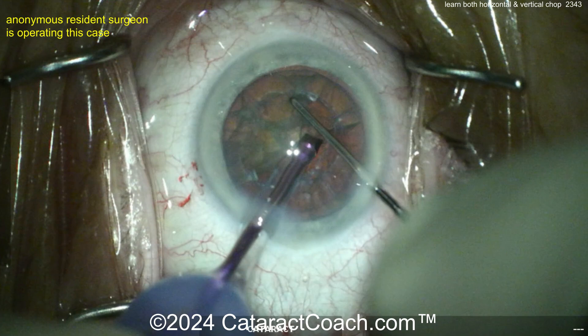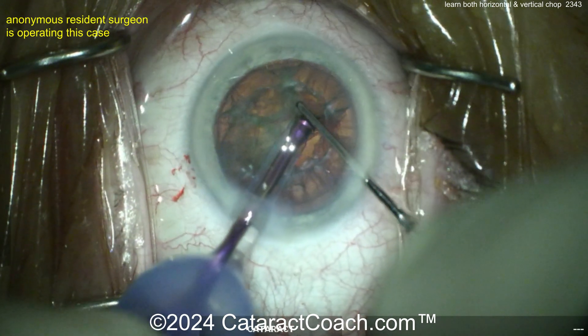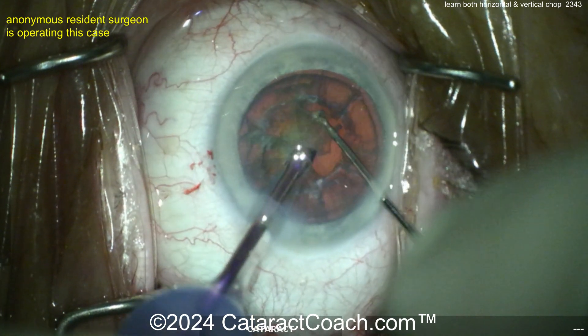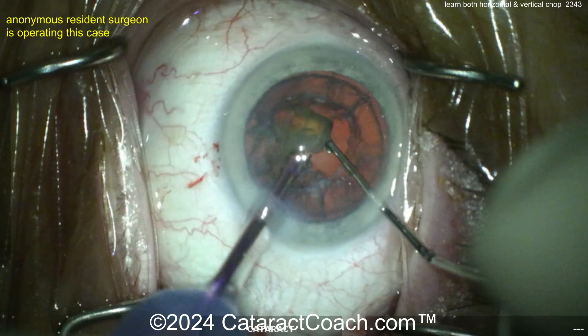When you do a divide and conquer, you're using a different setting to make the grooves and then a different setting to remove the pieces — so the quadrant removal setting is different. But here in chop, the FACO settings to create the chops is going to be about the same, if not the same, as your quadrant removal setting.